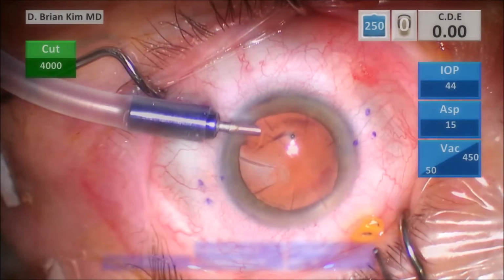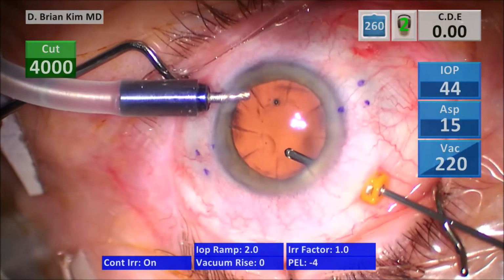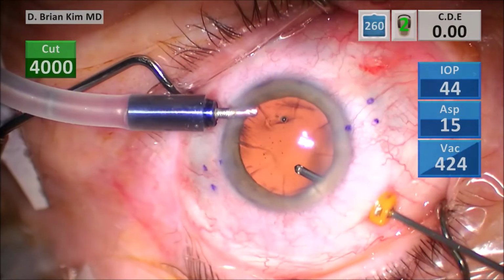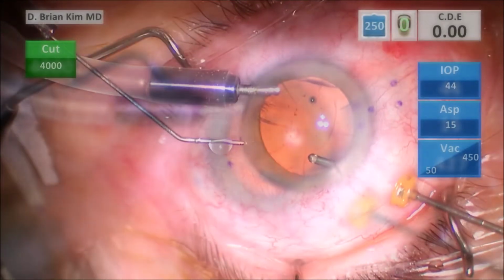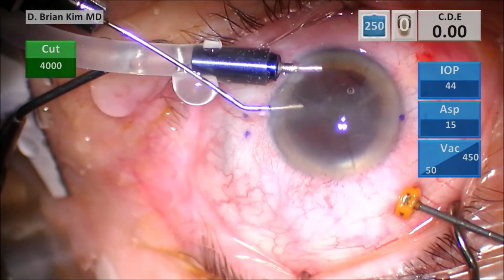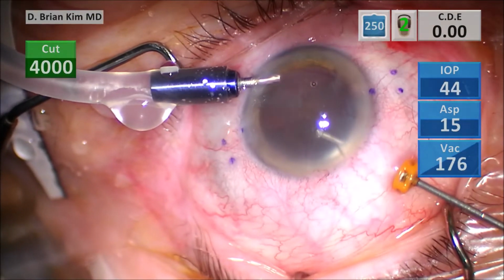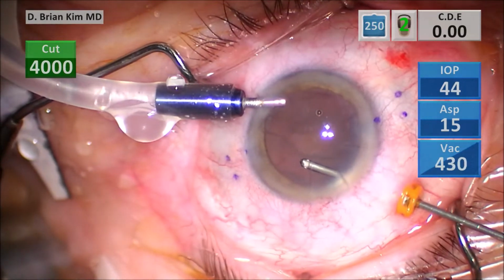And then I'm going ahead and do the vitrectomy. You can see this is so much easier to do the vitrectomy without the eye turning and so forth. We go ahead and inject some intracameral triamcinolone just to, again, confirm that I don't have any vitreous in the anterior chamber anymore. Again, I don't have any vitreous in the anterior chamber, which is excellent.